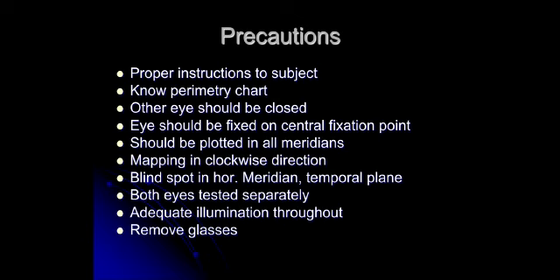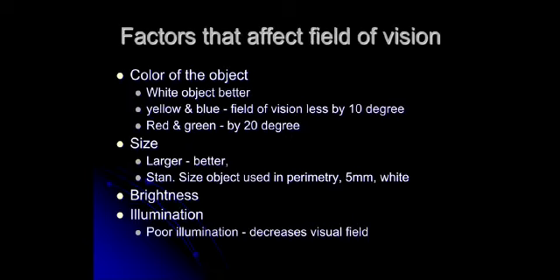The field of vision should be tested for both the eyes separately. Illumination should be adequate throughout the procedure. The subject should remove his glasses if he normally uses them, otherwise the field of vision will be restricted.